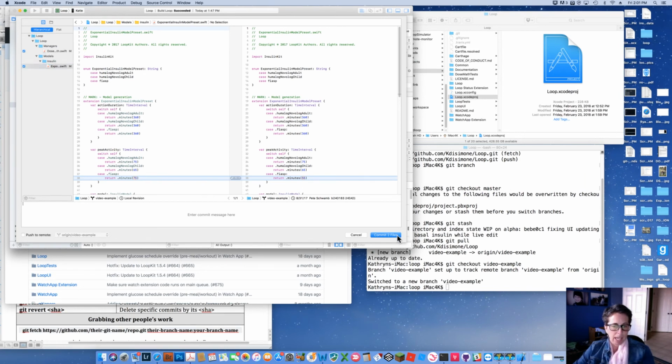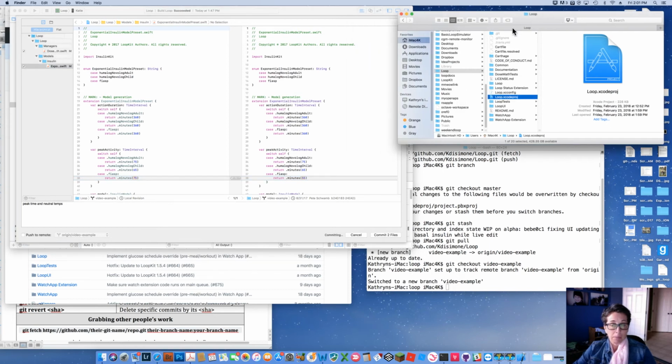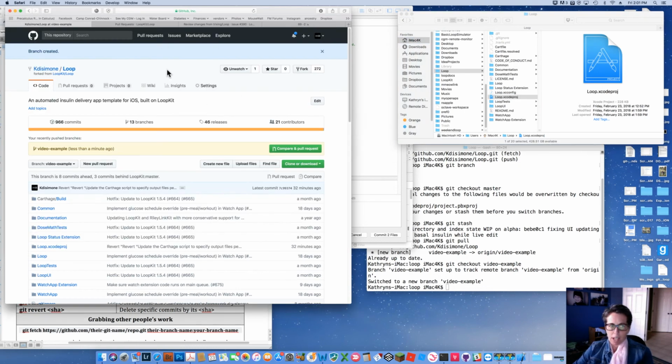If I try and commit that, I'll get an error message and it says I need to put a commit message in. Okay, I need to tell it what I did. Peak time and neutral temps. So if I did this now and committed it, it would save these changes, commit them as a record, an exact change of what was done, and it'll show exactly which lines were changed on my local computer, but it doesn't make it back up to my online Git account.